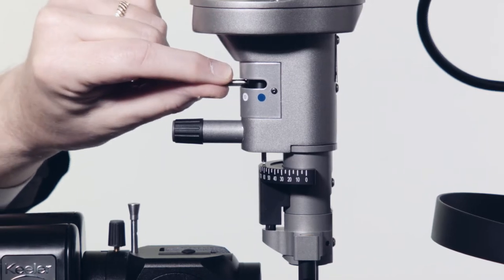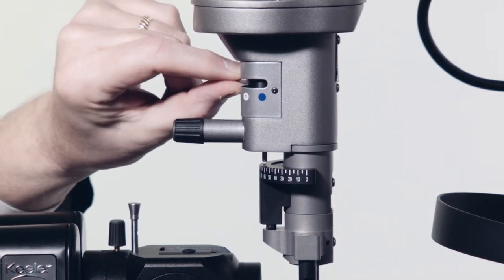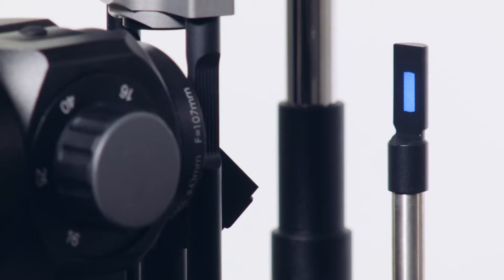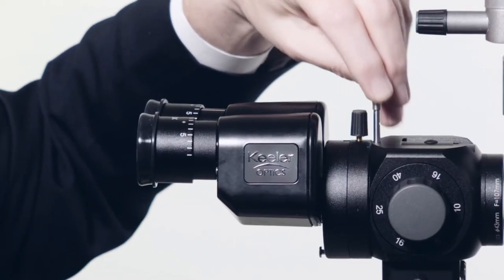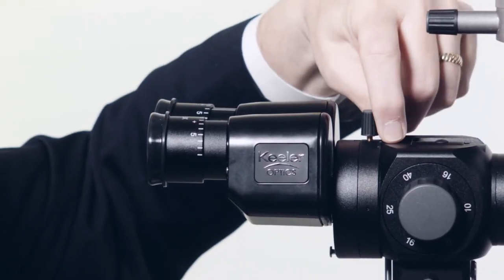The K-Series slit lamp offers a full range of filters required for examination. These filters are blue, neutral density diffuser, red free and clear. The yellow filter can be inserted and displaced by using this plunger.